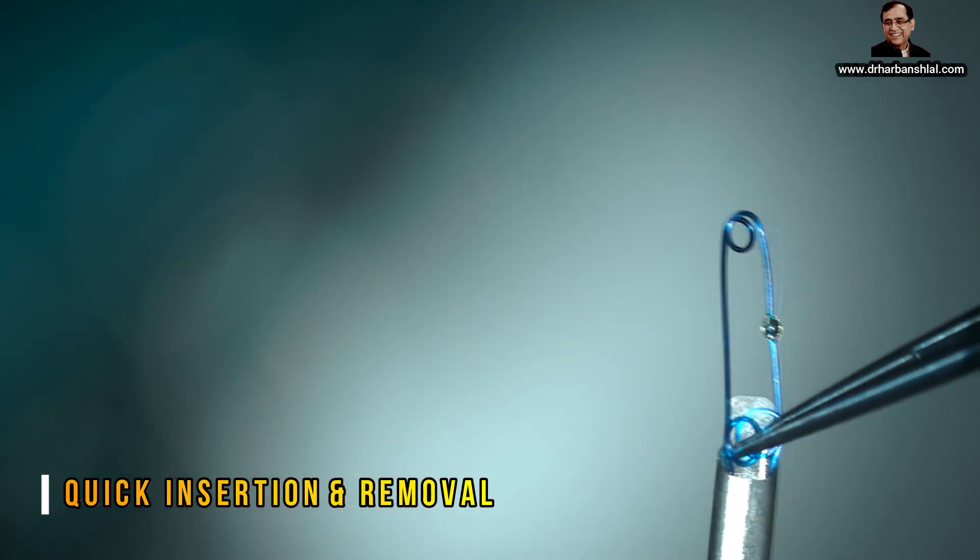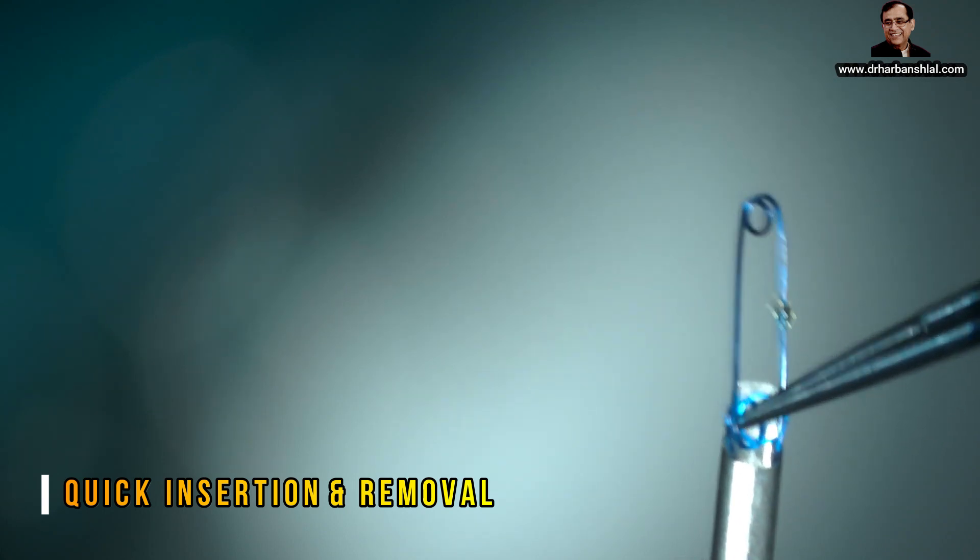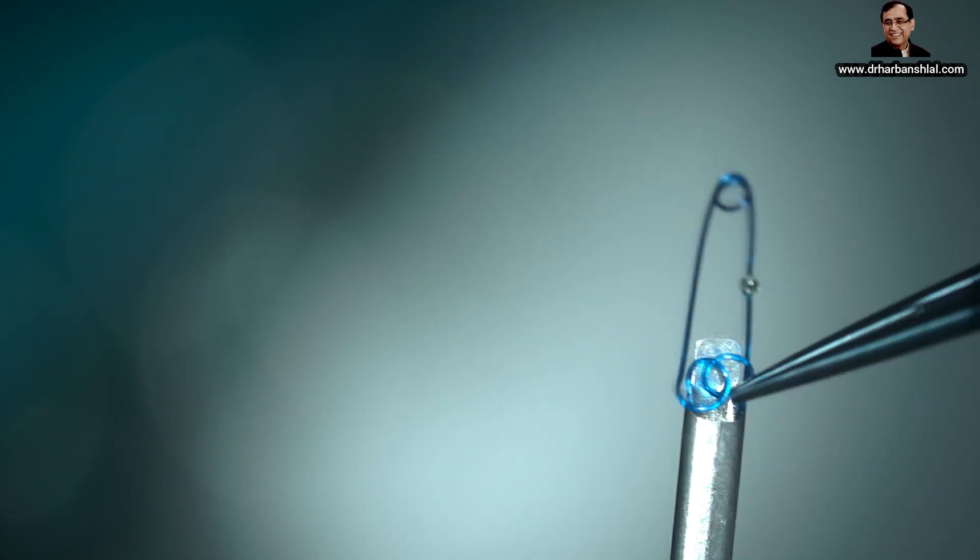It has got four scrolls to engage the pupillary border, and is an excellent product to be used and to be kept as an inventory by all eye surgeons.